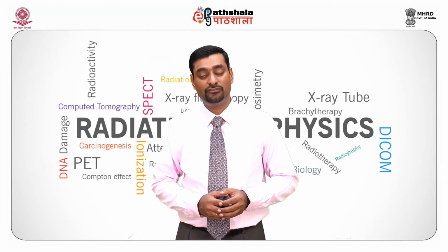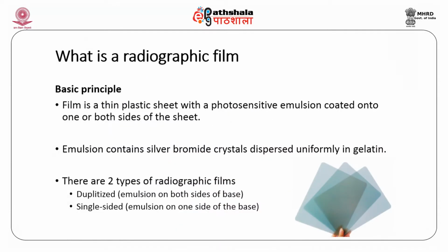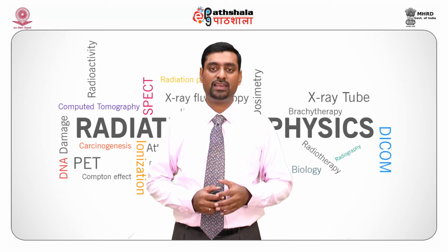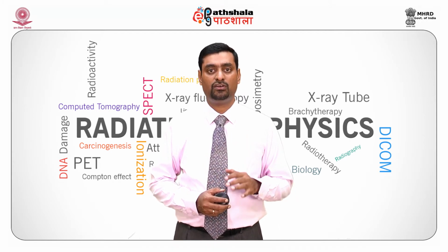What is a radiographic film? Let us consider the basic principle. A film is a thin plastic sheet with a photosensitive emulsion coated on one or both sides of the sheet. Emulsion contains silver bromide crystals which are distributed evenly in gelatin. So, this radiographic film is like a plastic sheet where this emulsion can be either coated on a single side or on double sides.